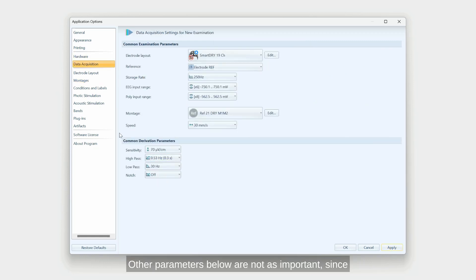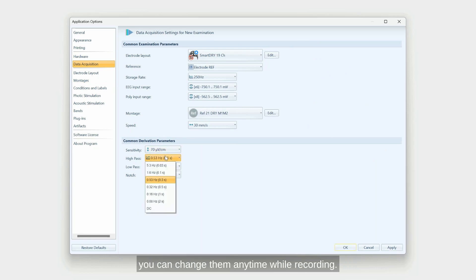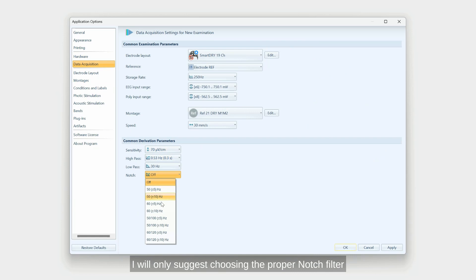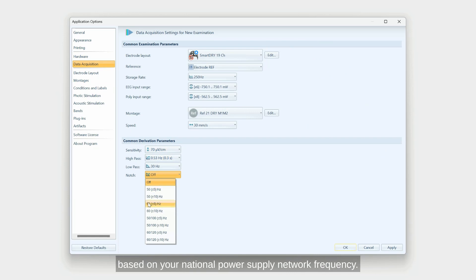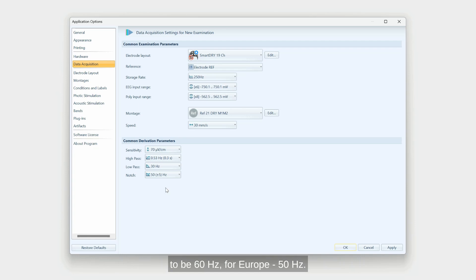Other parameters below are not as important since you can change them any time while recording. I will only suggest choosing the proper notch filter based on your national power supply network frequency. For example, for the US, it's going to be 60 Hz and for Europe, 50 Hz.